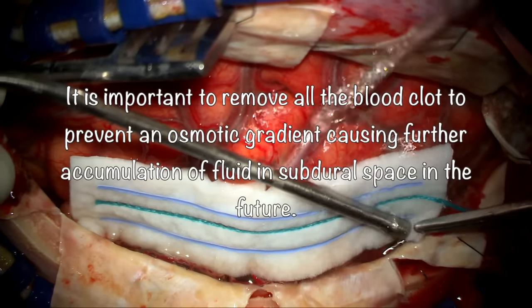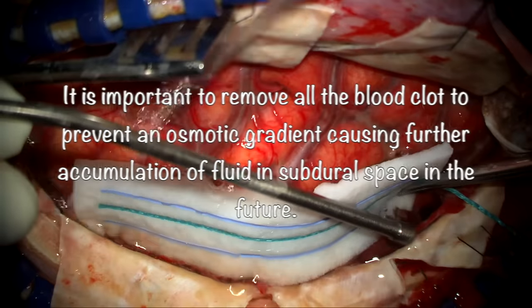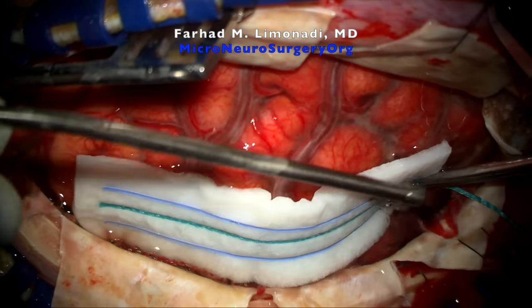It is important to remove all the blood clot to prevent an osmotic gradient causing further accumulation of fluid in subdural space in the future.